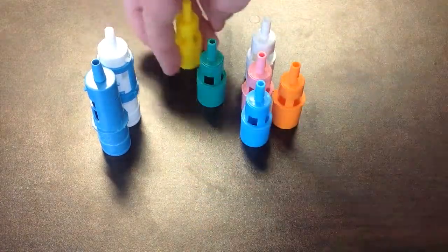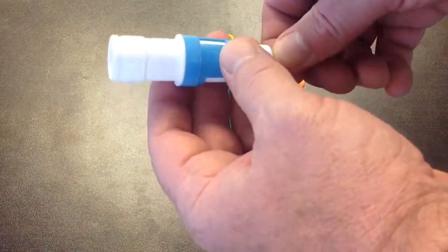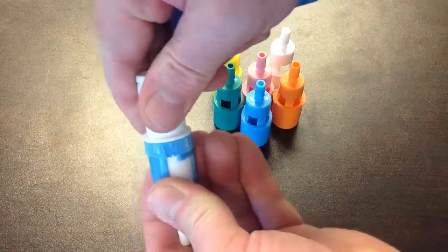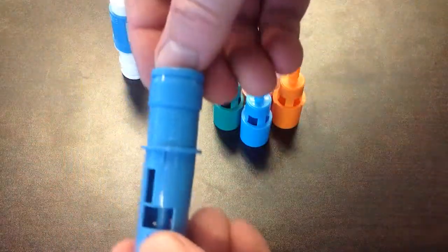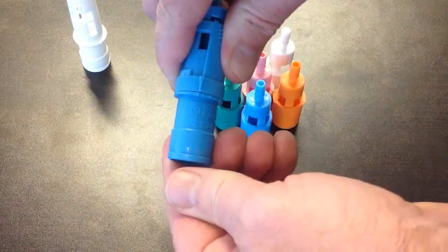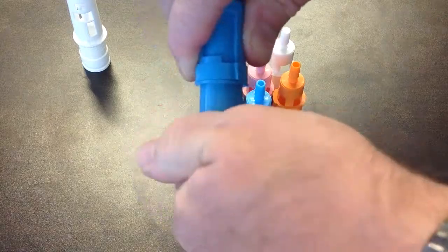Now I have two different styles here because in the hospital you may see two different styles. This one goes from, the white will go from 30% up to 40% all the way up to 55%. How you do that is put the arrow on the oxygen that you wish it to be on, and you can see the port changes. But if you need a lower oxygen, like on this one, it goes down to 24, you pull this off and put it on here. 4 liters, 31%. 3 liters, 28, 2 liters, 24. And that is how that one works.